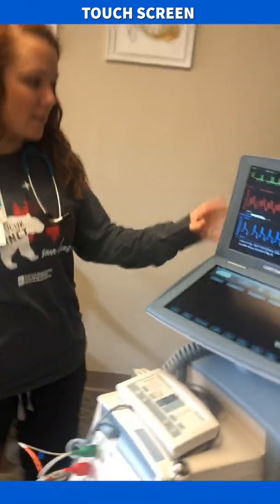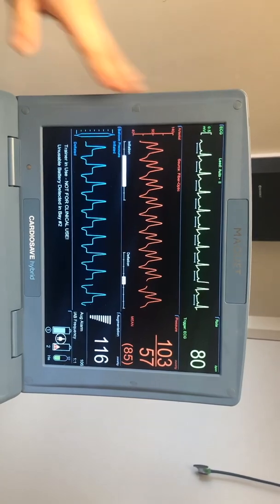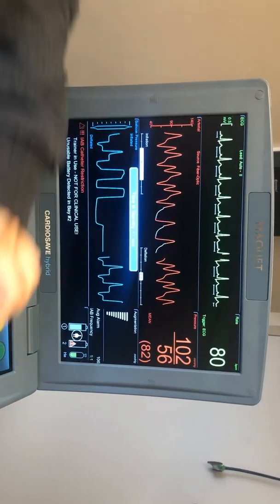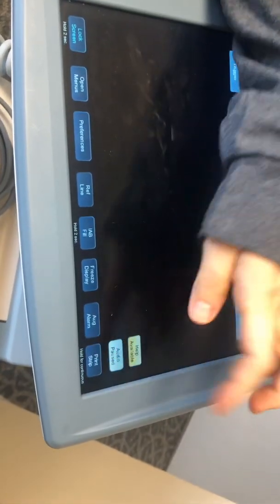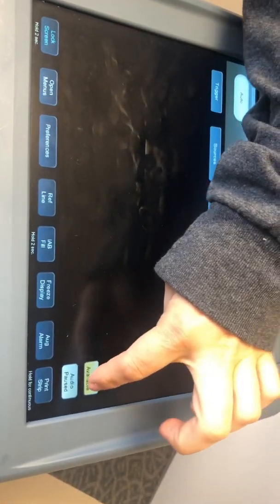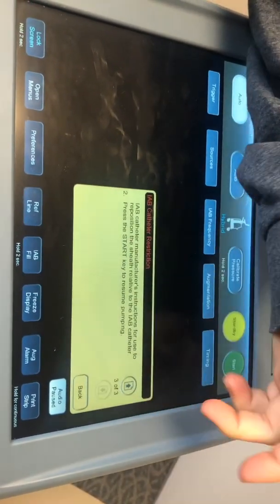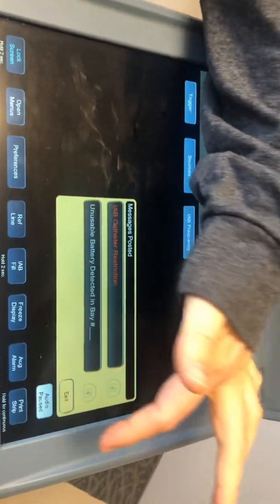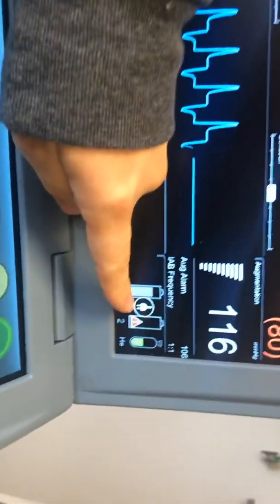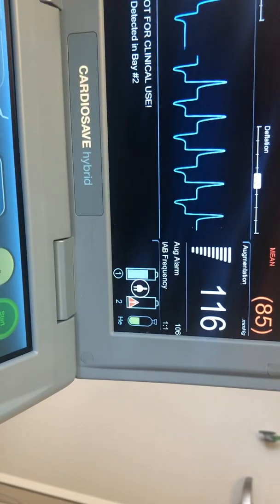Now we're going to go over the screens. The top screen looks very similar to the old one, and one of the differences is your alarms and any notifications are going to be down here on the bottom. Whenever you get an alarm you can go down here and hit pause audio, and that'll silence that alarm until you figure out what's going on. If you go to help available, you can drill into whatever is alarming and see what troubleshooting you need to do, then exit back. Over here it's going to show that you're plugged into the wall, and if you're not plugged into the wall it'll show how much battery life you have, as well as your helium level.